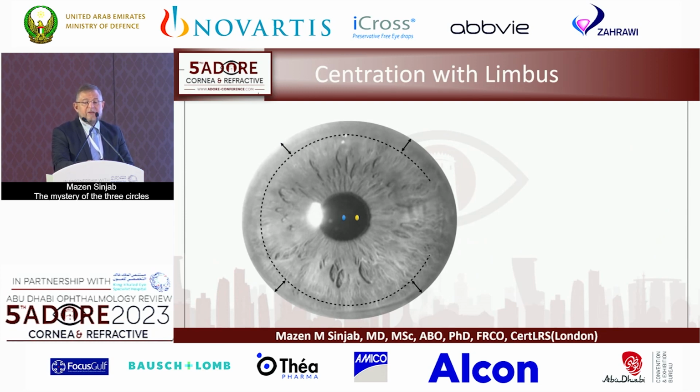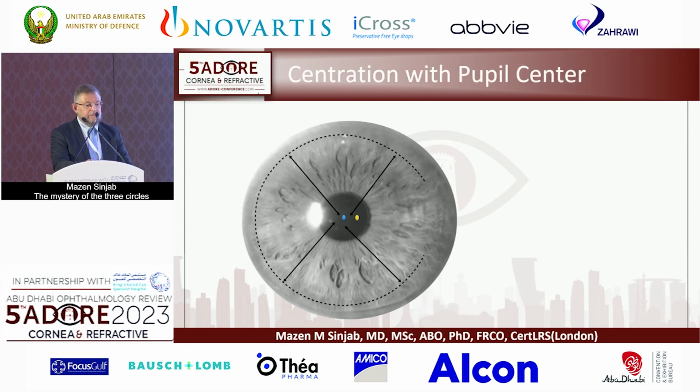Usually when we make the cut, either we center the machine with the pupil, with the limbus, especially if you are using microkeratome, usually we center the ring to be symmetric according to the limbus. So in this case, we are choosing the geometric center of the cornea, and we do the cut. Great.